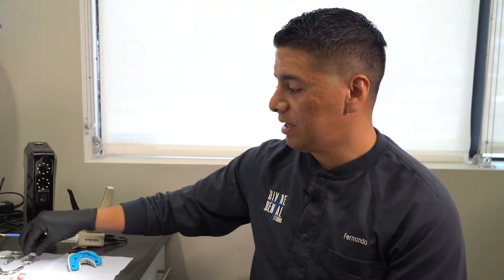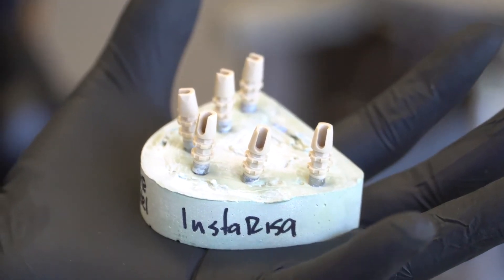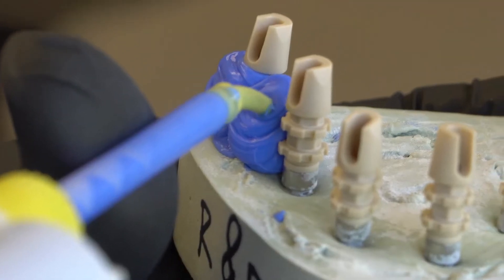Here you can see we have a lot of titanium bars where we do a lot of research and development for InstaRisa. We basically check everything — the passive fit, everything — with titanium bars. This is our workflow, and it's a pending patent workflow recipe that we provide to digital dentistry.